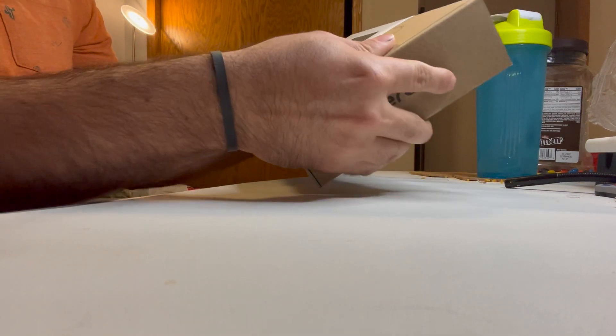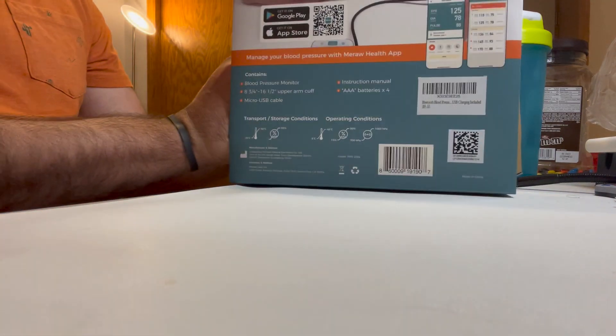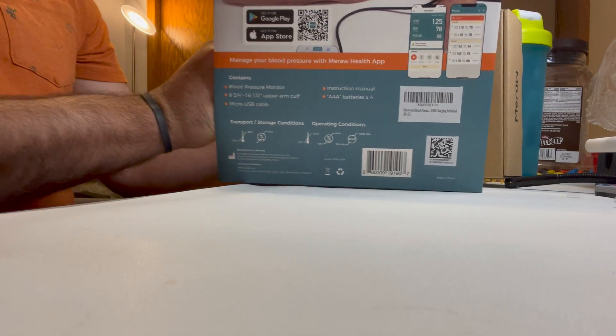And then I think it's like a pull-out design. Here's some of the details that are on the box right there, which are really nice.